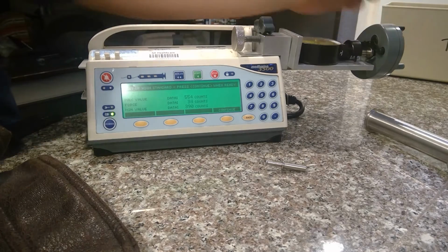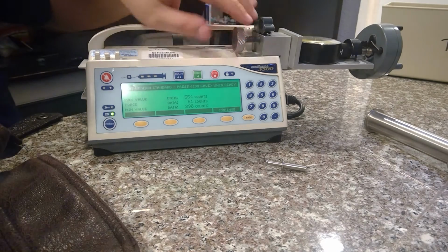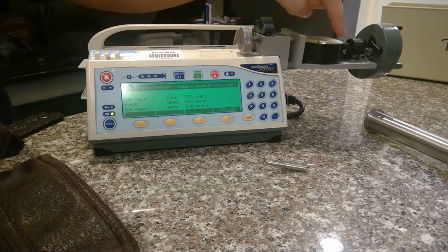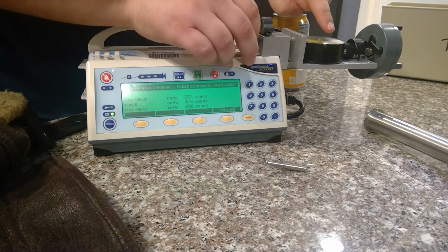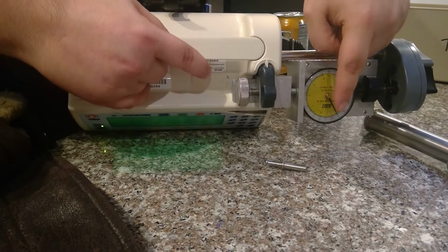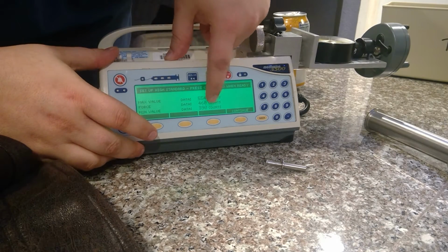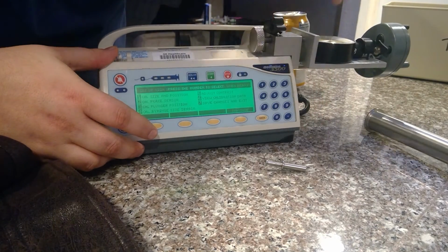Now it's going to do high. You're just going to turn this until you hit 10 pounds on this. 10 pounds is on the outer diameter. Yeah, right here, the 10. If you guys can see that. It says 10, the 1 and the 0 put together. And now you should see that it should be in between 390 and 554. Hit continue, and you're done.